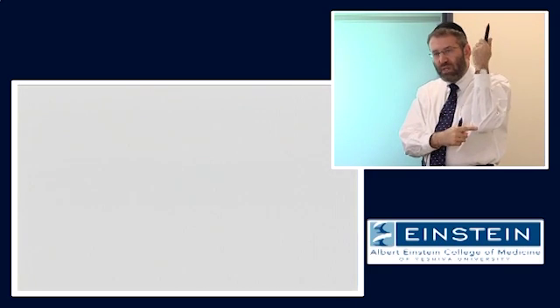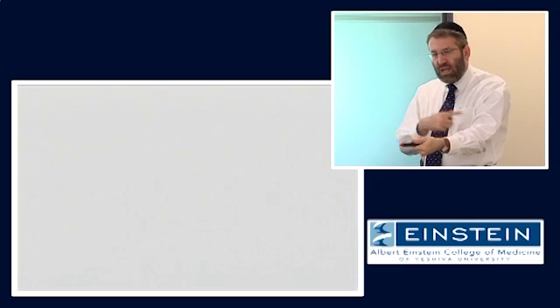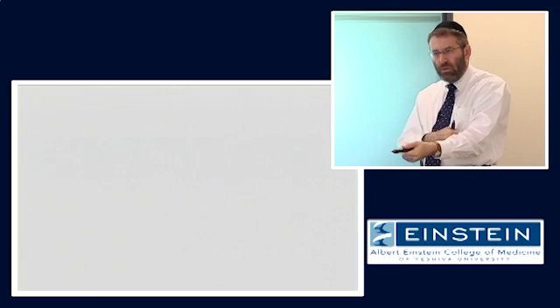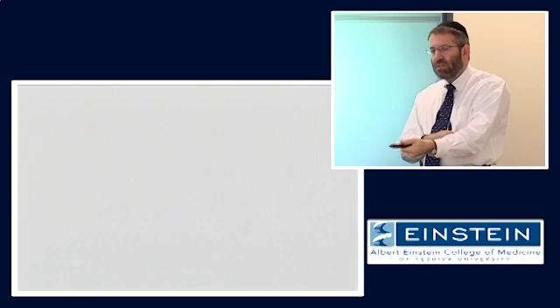Which means that if we now repeat this again, in other words, if our TR is very long, every time we repeat our RF pulse, if we wait a long enough time, we will have that same large amount of transverse magnetization. What happens if the TR is shorter?